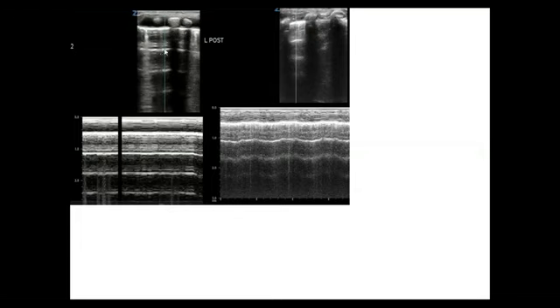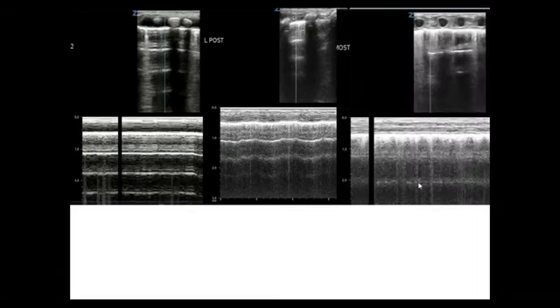This is the same patient with the pneumothorax after tapping of the pneumothorax, and we started to see some echogenic dots and a less prominent barcode sign or A lines. This is after complete tapping of the chest. Now, instead of just sea, you can identify the sky, sea, and sand. It will appear like a granular appearance of sand at the surface of the lung.